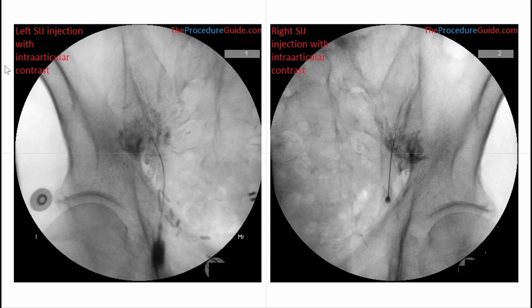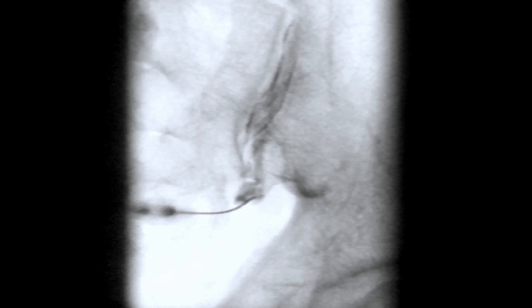So make sure you are in the right place. Once the tip of the needle is correctly placed, its position is checked under continuous fluoroscopy while moving the C-arm in the right and left oblique directions. On dynamic fluoroscopy, the needle tip should remain within the joint line and not appear outside of the joint line. If the tip of the needle appears to be on the bone out of the joint line, it is not the correct space. Please watch repeatedly — it will give you the insight to delineate the joint line. Enjoy the show.